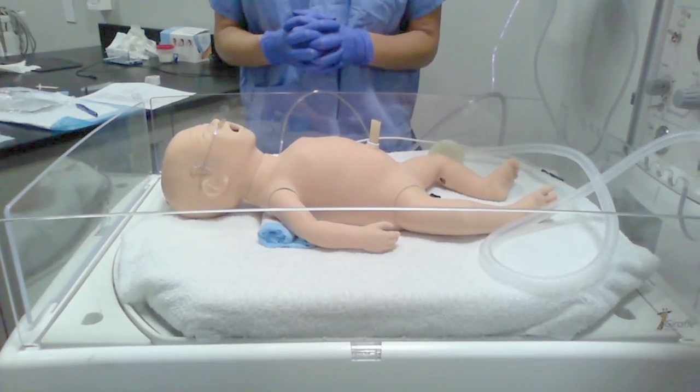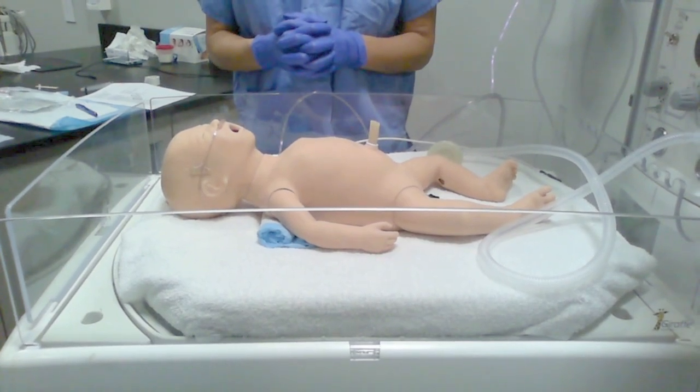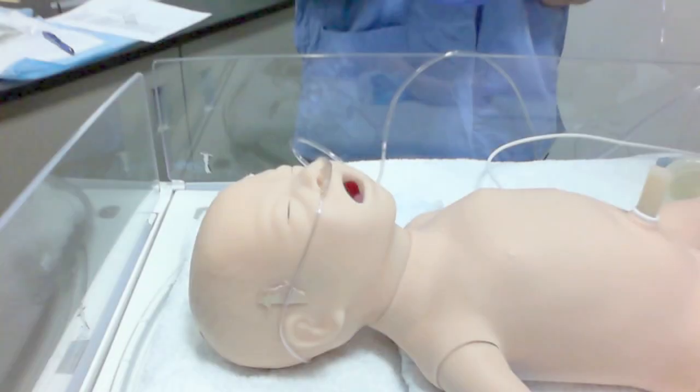Today we are going to demonstrate a neonatal intubation. First, you will need to ensure your baby's respiratory status has been supported while you get your equipment ready.